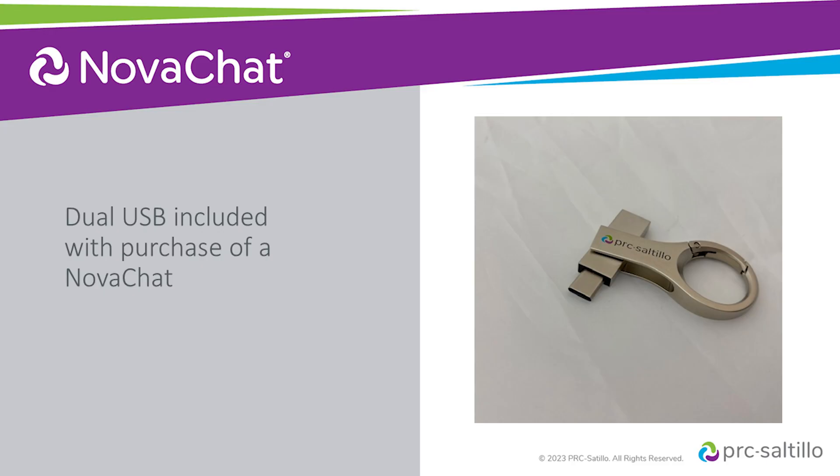You can use the dual USB that comes with your NovaChat to back up and transfer your customized vocabulary file. Start by swiveling it so that the smaller side is visible. For some NovaChat devices this will be a USB-C end, and for some NovaChat devices this may be a micro USB end.